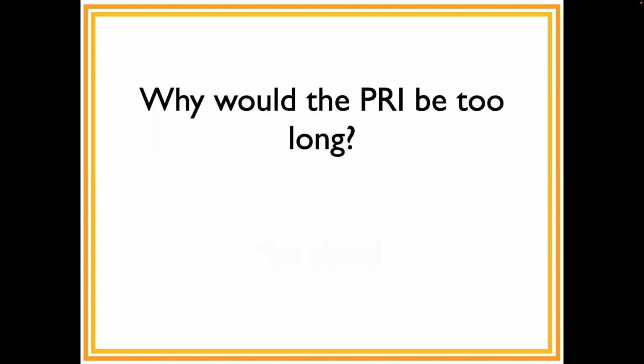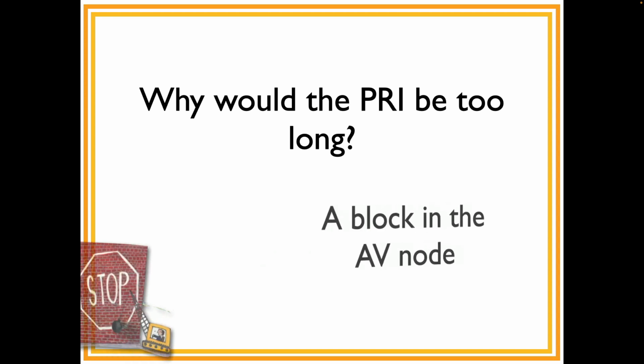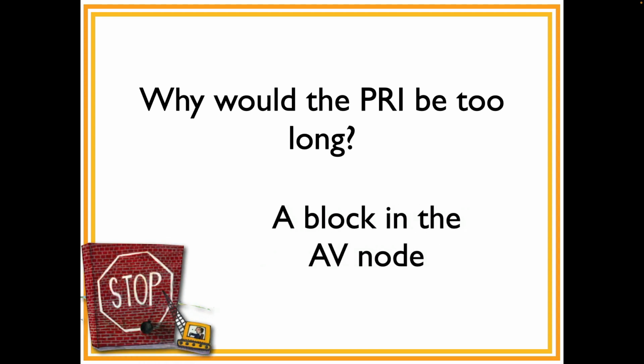Now, why would a PR interval be too long? You're going to see PR intervals that are greater than five small boxes if there's some kind of block in the AV node. So, AV blocks, okay? We'll get to that at the very end of this term, when we talk about AV blocks.